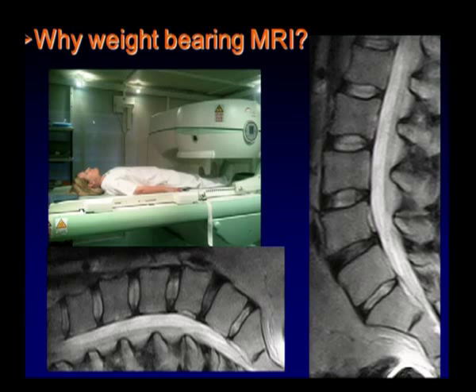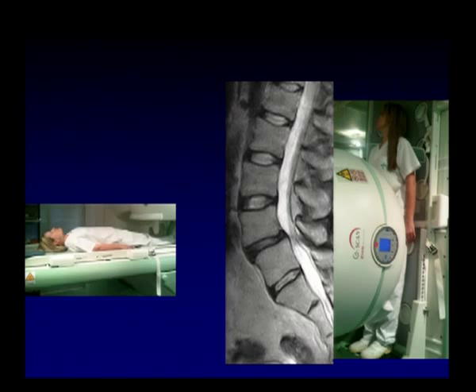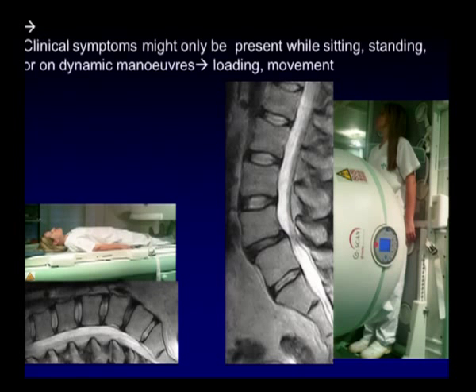The patient was in this position. It would change if I performed a standing MRI of the lumbar spine with this patient, and then I would get the correct examination in the position that the patient has been performed. So we can see it's a completely different analysis of the morphology once it's performed in the supine position or in a loading position.